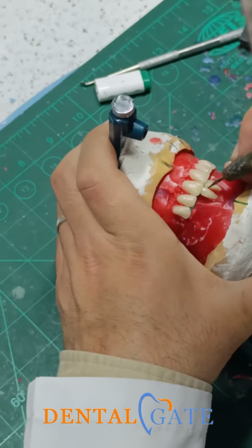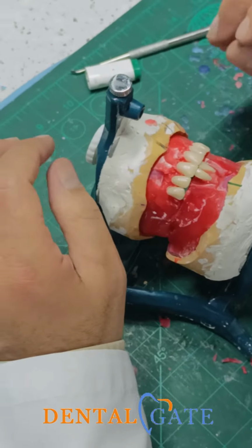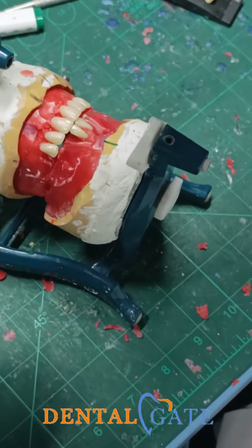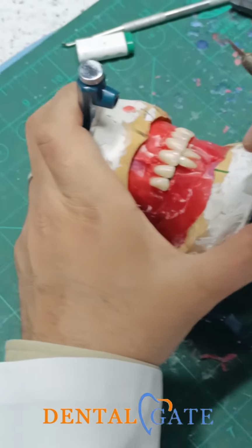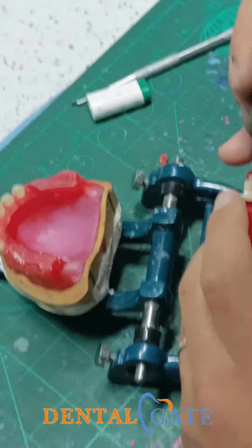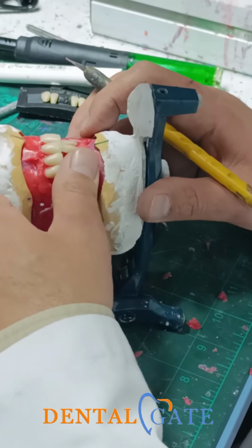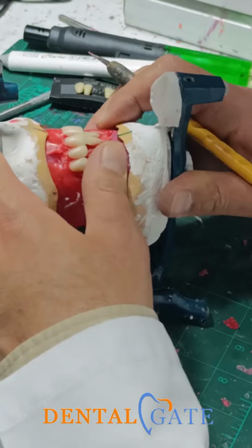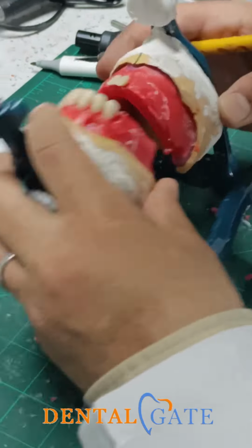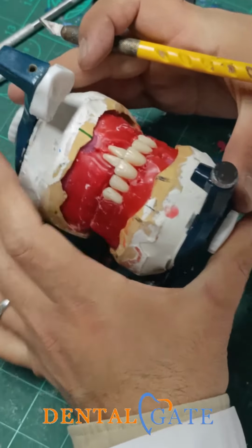Now I think we can make a lateral, but don't make another tooth. Please make sure all criteria are performed on one tooth. After that, make another one. Okay? Because a mistake will be followed on to all teeth. Yes, it will be continuous. I think it's good. What's your opinion about this arrangement, about the midline? It is good now, okay?